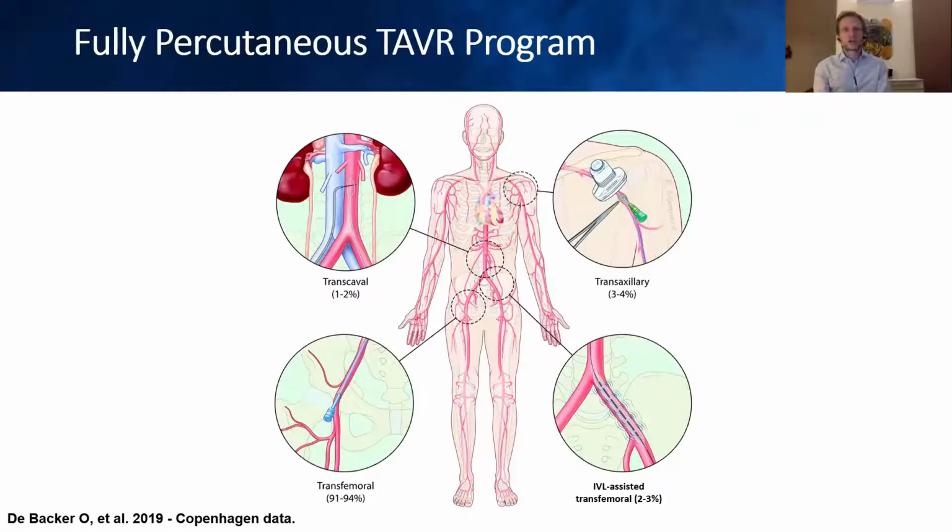So as a summary, as I showed you before, we can do our entire program, having now nearly 400 TAVR cases, by a fully percutaneous approach.